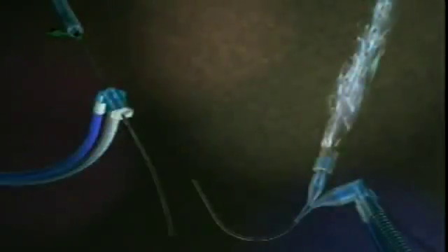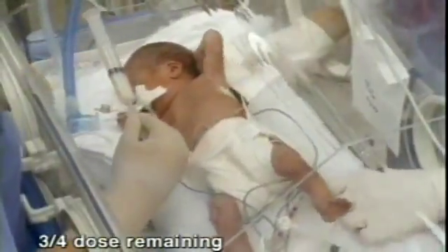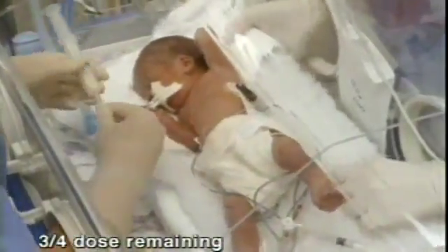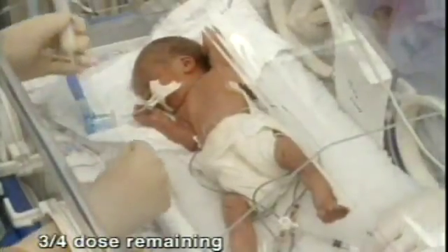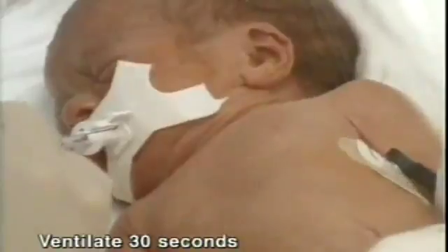In the NICU, Surfactant may be given through a suction adapter. If so, be sure to cut the catheter long enough to accommodate. Gently incline the infant with the head and one shoulder up. You can use the bed to position the infant if you prefer. Administer the first fractional dose. Ventilate for 30 seconds.